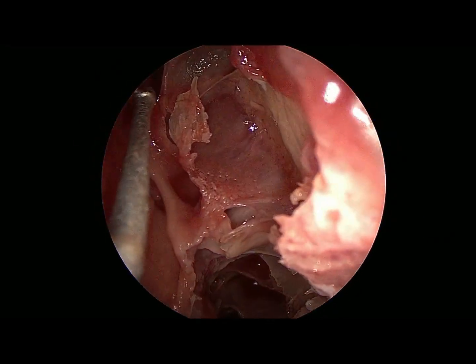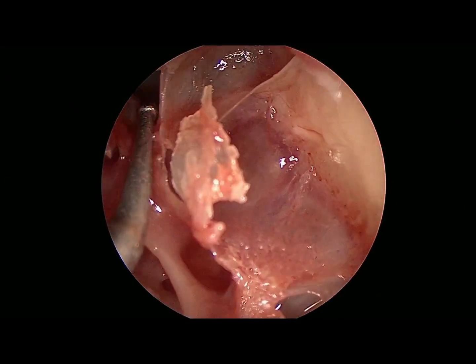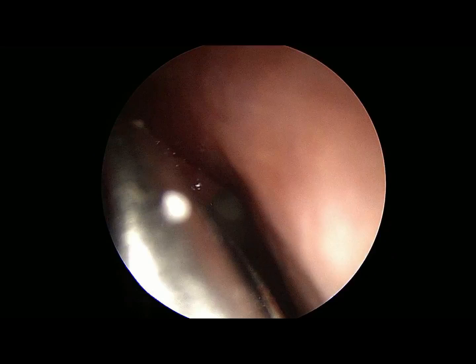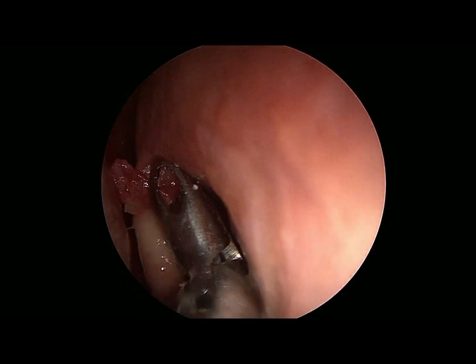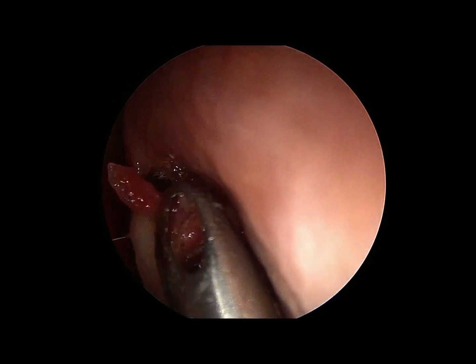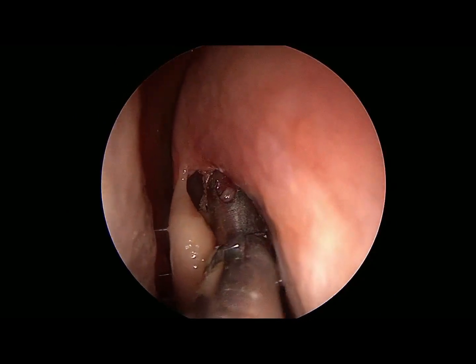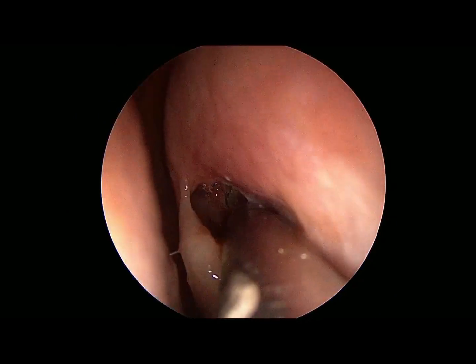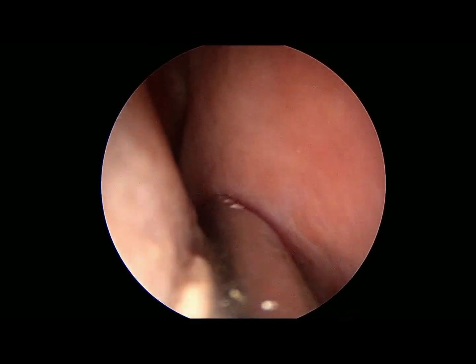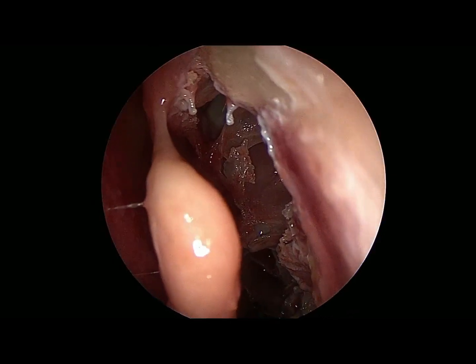See now, the posterior-most wall part of the agger cell is removed, then you are able to see the frontal sinus. Most of the time it is the cells that are in the frontal drainage pathway which will dictate what type of drainage the patient has. So CT scan is the most important thing we need to study.